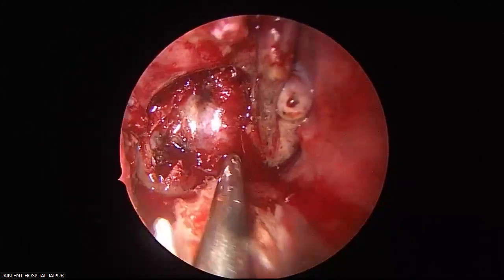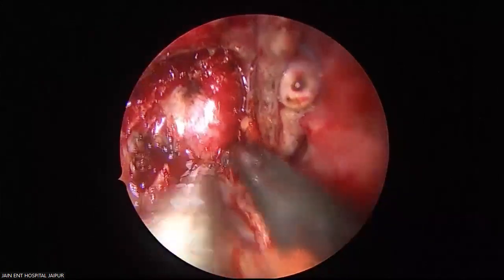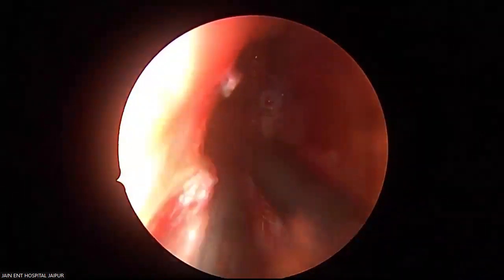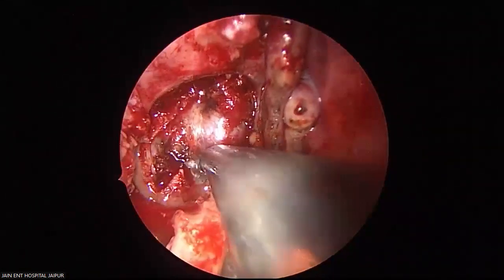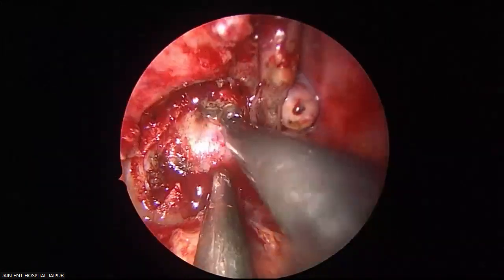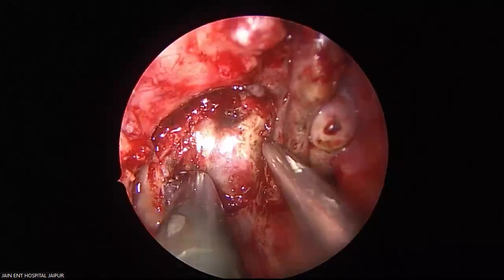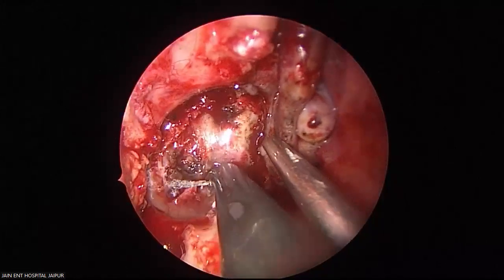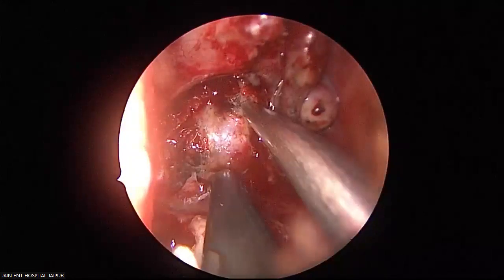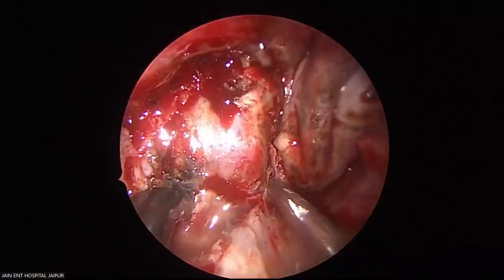See, dynamic MRI is useful to assess the circulation. It aids in differential diagnosis sometimes, to differentiate tumors like schwannomas from JNA, which have contrast enhancement at a certain part of the cycle after the contrast injection. Here, it is not so useful as far as the diagnosis is concerned, because angiography is adequate to give you information about the feeders.